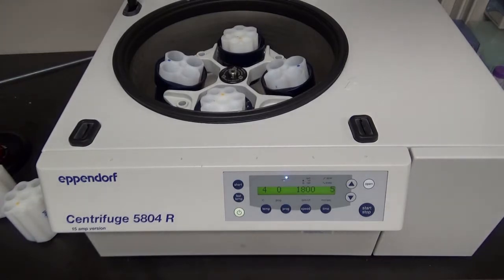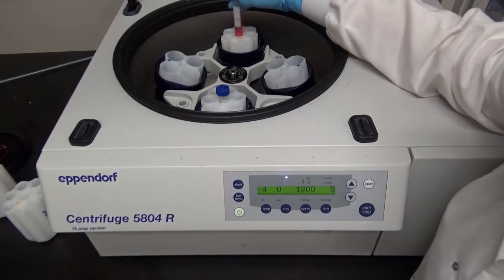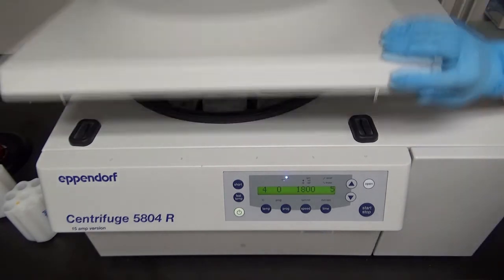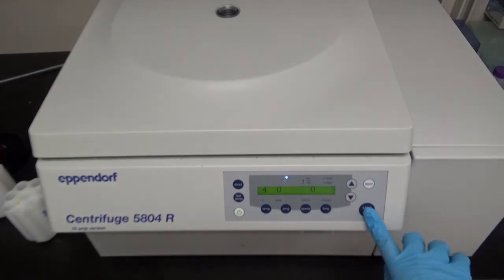Centrifuge the tube at 1500 times G for 5 minutes to remove any excess freezing media. Spin speed and time requirements will change with each cell type. Be sure to find the best settings for your cells.